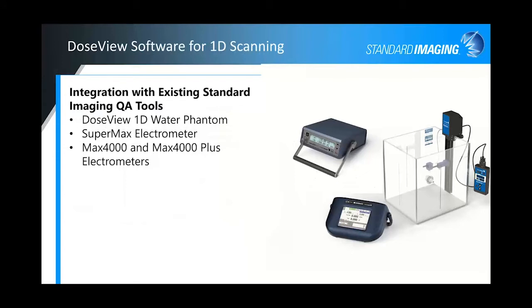It integrates directly into our 1D Phantom, obviously, but then also with our Super Max and our Max 4000 and 4000 Plus electrometers. So it allows you direct connectivity to those systems and utilizing those for your data output.